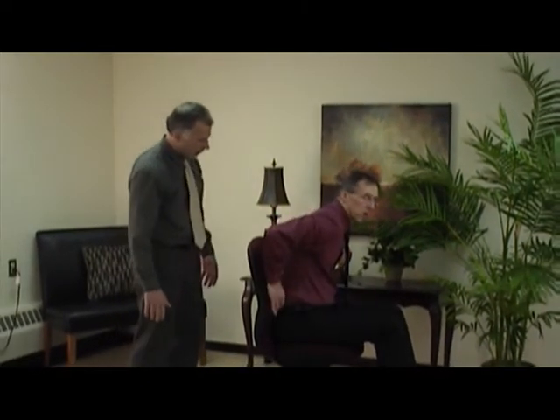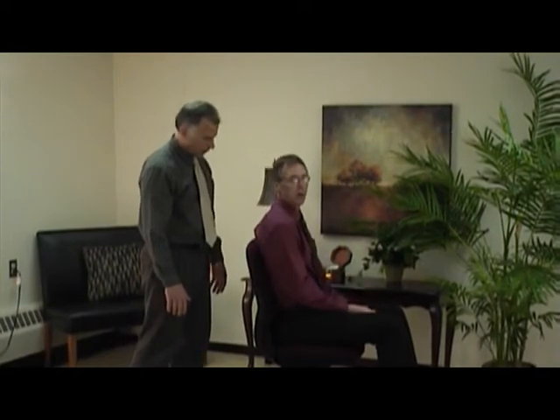It's going to feel like very good support. So Bob, why don't you go ahead and adjust that if it was not in the right place. Let's go down just a hair now that I've been sitting a while. Now it feels better, a little bit lower. And that's a good point.